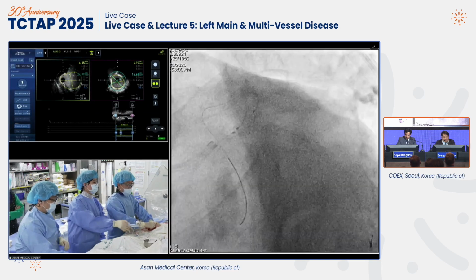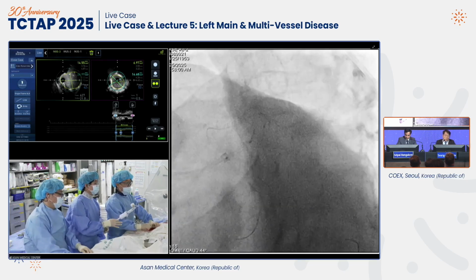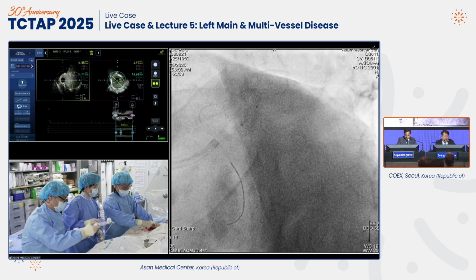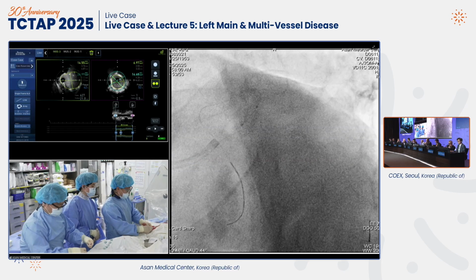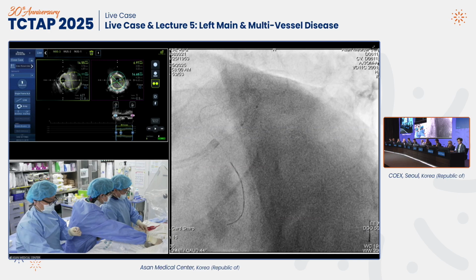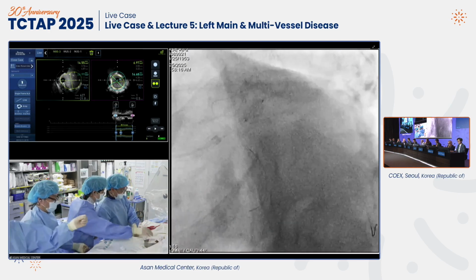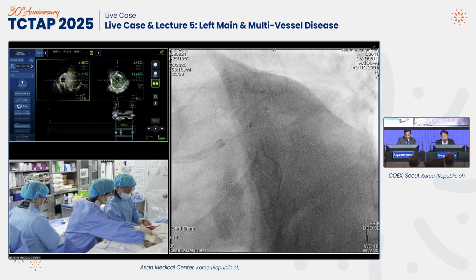Depression. So before removing the stent balloon and the wire, at this moment we're going to apply additional high pressure using an NC balloon, which makes it much easier to re-access the ostium. Wiring and the NC balloon 3.5. Okay, slowly. This left main stent is about 4.0.